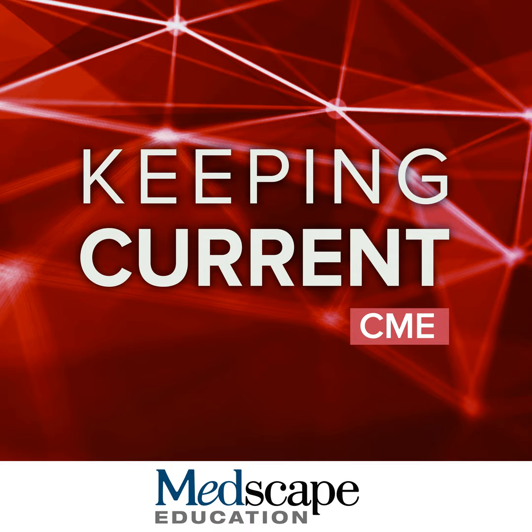So this is a different case, another MASH cirrhosis patient, a 61-year-old man with normal AFP. Same thing, comes for HCC screening. And then we see this tiny lesion in the back of the right posterior lobe next to the kidney that has arterial phase hyperenhancement. There's no portovenous washout. However, there is hypointensity on the delayed hepatobiliary phase shown on the bottom left, and also some diffusion restriction, but no T2 hyperintensity. So this was not a hemangioma based on the findings because of the size.